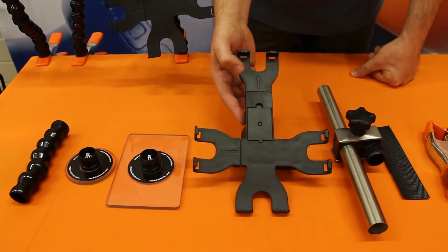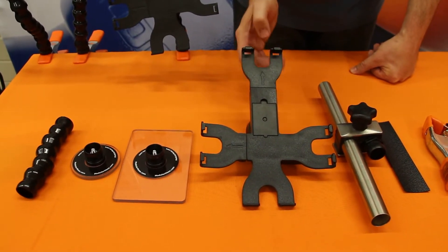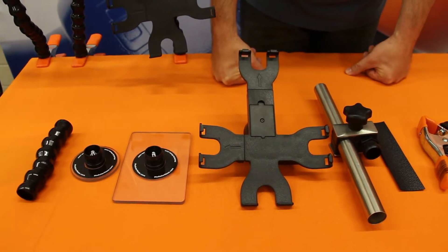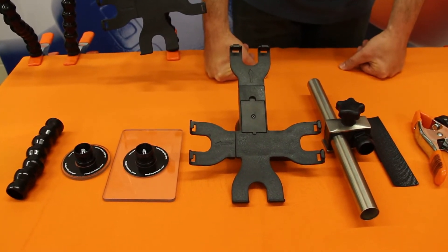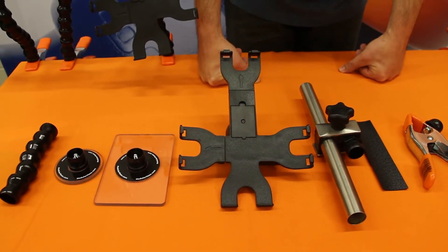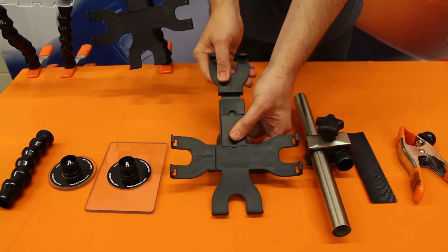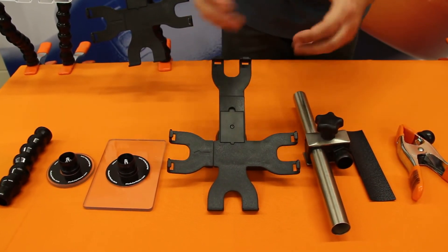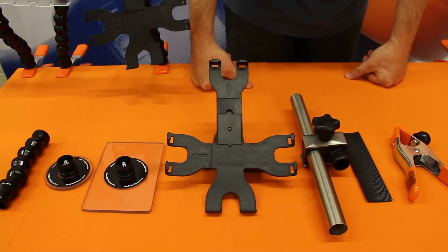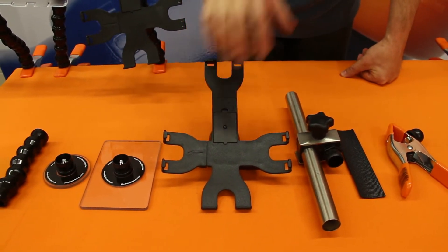The next item is our iPad holder. This specifically works for the iPad 1 through 4. It does not work for the Air or the Mini, but we do have other options for supporting those devices. It is a spring-loaded tablet holder with a strong spring that holds your tablet device in place. You can buy this separately or as part of a kit.